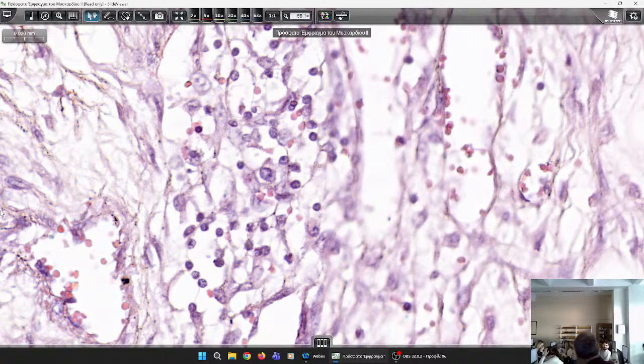However, in this case, we do not see the area of the granulation tissue, but on the background of the old infarct, we have a recent one which killed the patient, probably due to arrhythmia, because this is the most common fatal complication in the first 2 days after the infarct. So he had a fatal arrhythmia that stopped the heart.